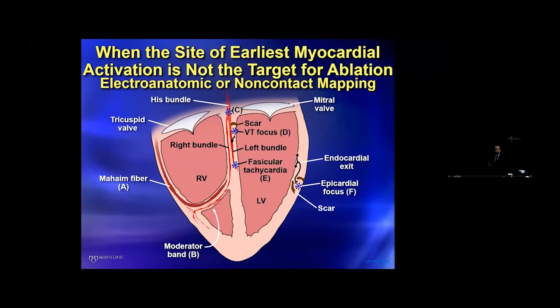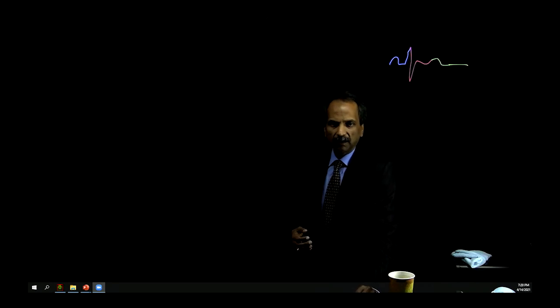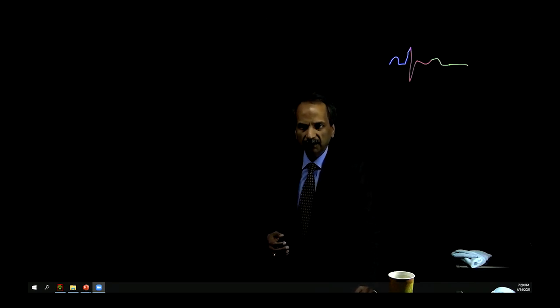I know we have several questions that we should discuss, but these are two that I would say are thematic. Find the right signal and understand when the early site is not your target. So always two good checks when we feel we can't understand a map or we're failing to ablate an arrhythmia. So, Char, I know you put up the questions. Siva, Abhishek, anything that you feel we should tackle first?